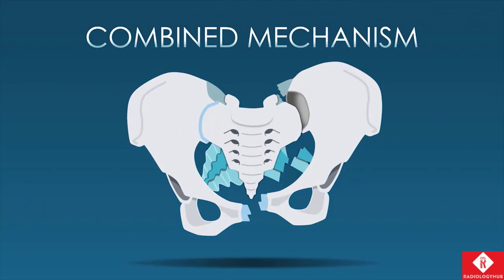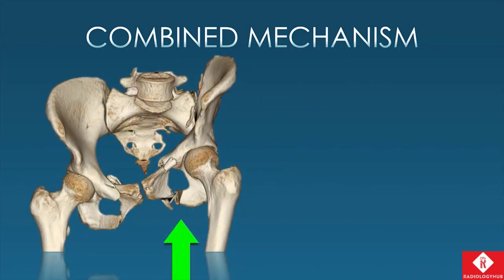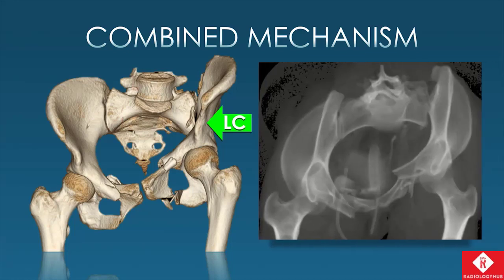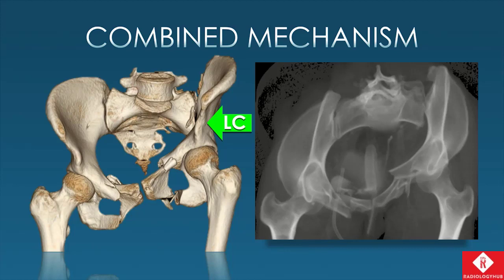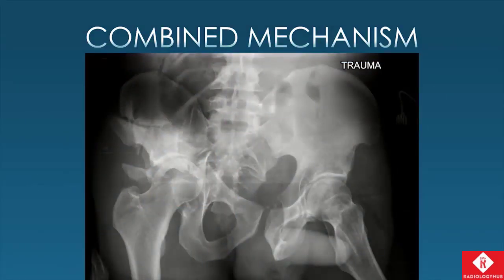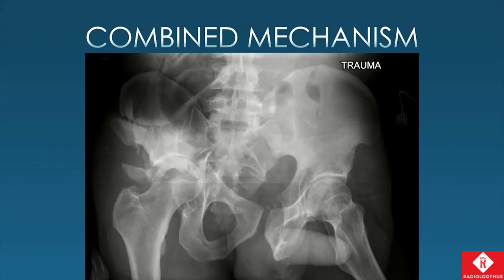The combined mechanism, as the name suggests, involves more than one dominant vector or really no dominant vector. These are typically reserved for co-dominant vectors — where you see features of vertical shear but also something that fits with another injury pattern, such as lateral compression. For example, there may be some vertical separation of one hemipelvis combined with lateral compression and internal rotation on the same side. On the inlet view, we can also see that there's an anterior-posterior compression force involved as well. Another example: lateral compression type 3 with windswept opening on the opposite side but also with vertical separation — this we would call a combined mechanism.